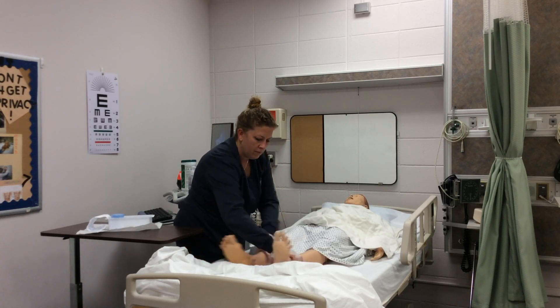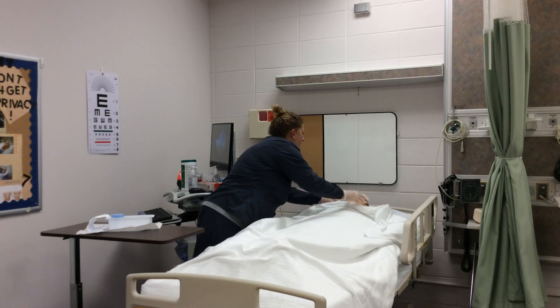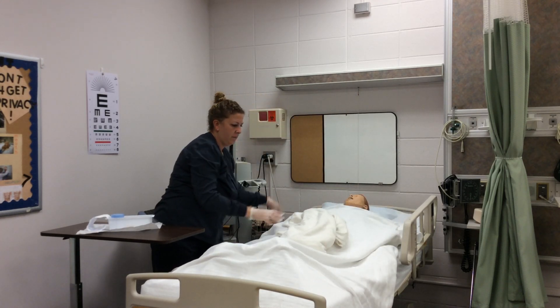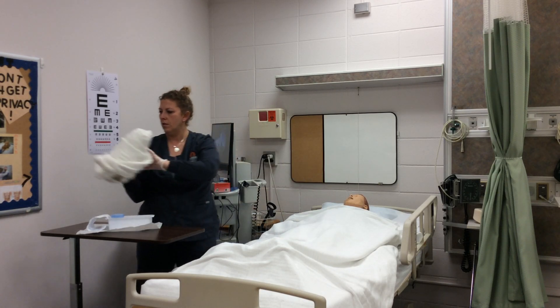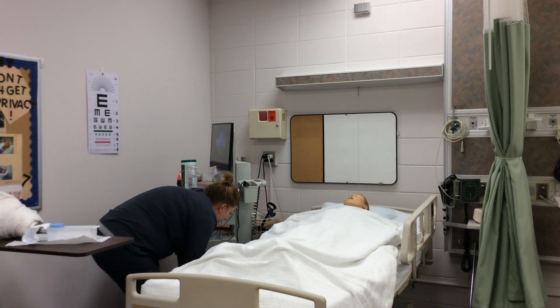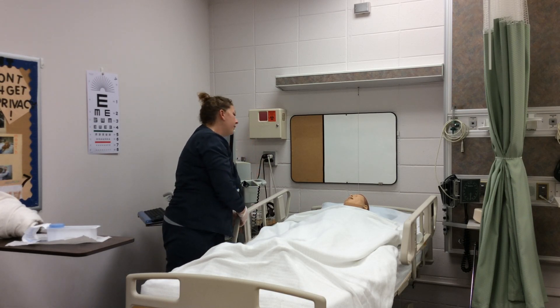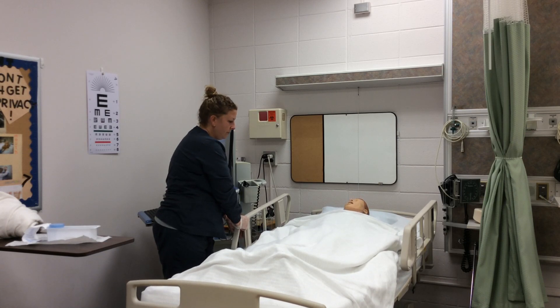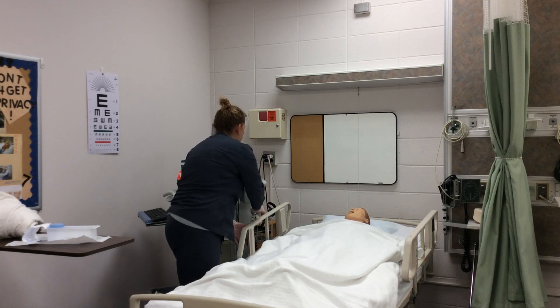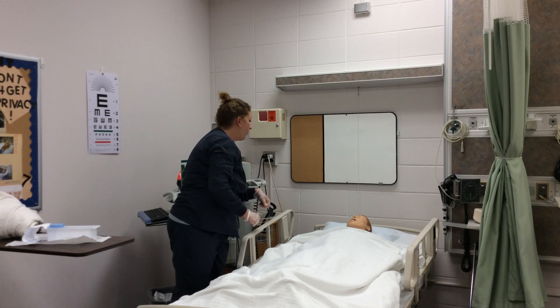She removes the bath blanket, makes sure the patient is comfortable, and maintains safety by lowering the patient's bed and raising the side rail. She asks: 'Are you comfortable?' and lowers the bed back down, confirming the patient has the call light accessible.